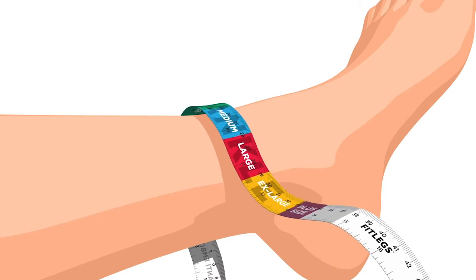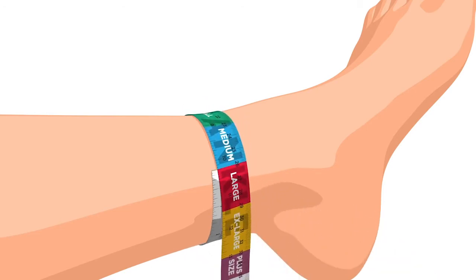If a patient is borderline between 2 sizes, they should be fitted with the larger size. This will be more comfortable while still providing the necessary compression.